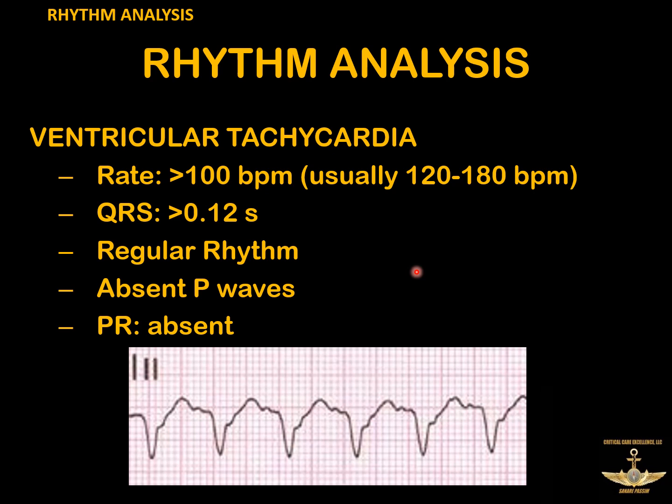Now, an important thing about this is that unless it's acted on by medicine or electricity, VTAC is going to be regular. Now, this is important when you compare it to if you have somebody who has atrial fib.